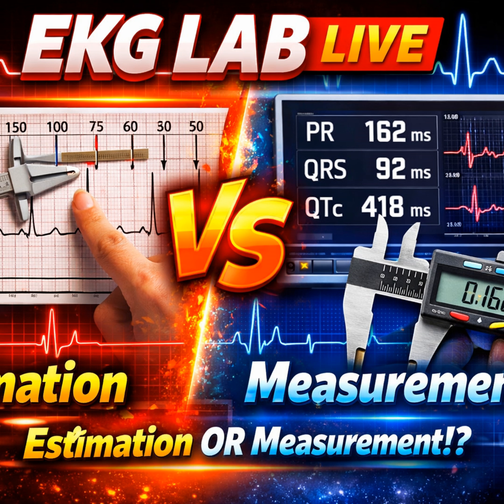Brugada syndrome. This is a genetic defect in cardiac sodium channels, a leading cause of sudden cardiac death in young men. The sign can be incredibly subtle. You are looking for a coved ST segment elevation greater than 2 millimeters in leads V1 to V3. Which is a visual pattern. It looks like a shark fin. It is a measurement. If you just glance at it, it looks like a bit of noise, or perhaps an early repolarization pattern, a benign variant. You have to stop, engage System 2 thinking, and count the millimeters. Is it fully 2 millimeters? Is it followed by a negative T wave?